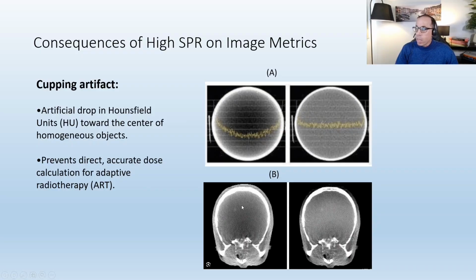Here, we know that it is soft tissue, but it shows itself as air, as a low density material. After artifact removal, you can see that it is uniform density material. Cupping artifact causes darker points and lower CT number in the central part. It is the thing that you can see on the images.